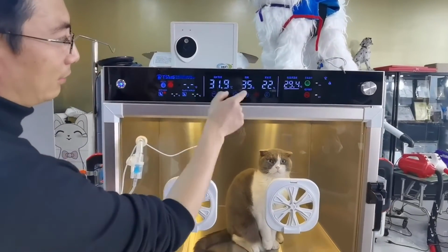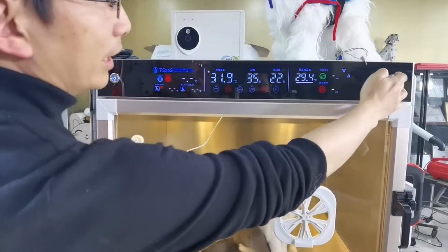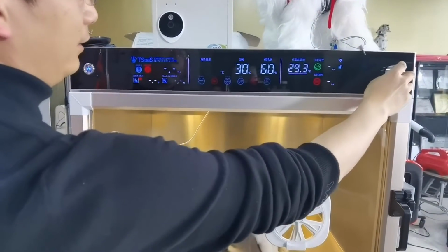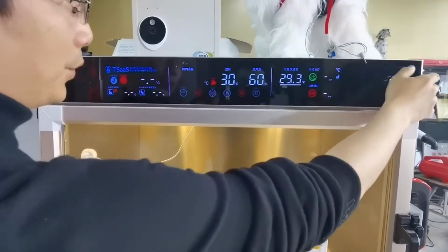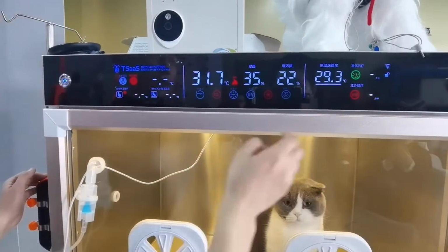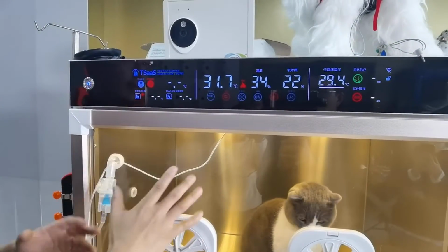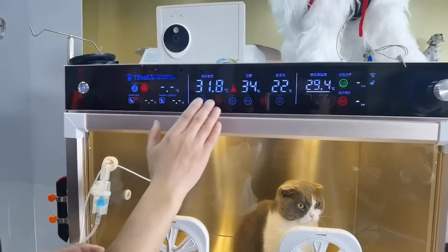Now, here is the setting for the internal compartment temperature. When I press the button to unlock it, I can just press the temperature and set it. It's blinking. Ta-da! You can see the flame comes out, showing that the heating process is going on. I stop it. It keeps in memory, it's going to work, okay? Humidity: this one needs an external humidifier to realize high temperature and high humidity. This one does not have a built-in humidifier.